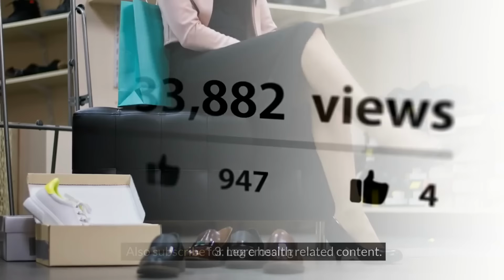For these reasons, it is essential to place the cuff directly on the bare skin of your upper arm. This ensures that the cuff can inflate and deflate correctly, applying even pressure and providing a true reading of your blood pressure.